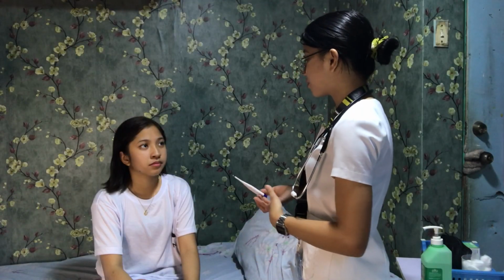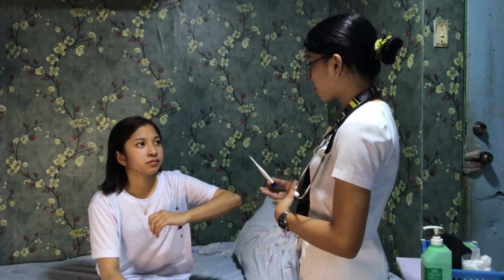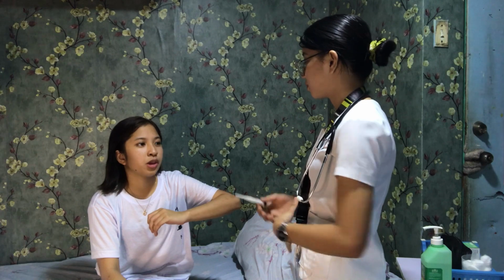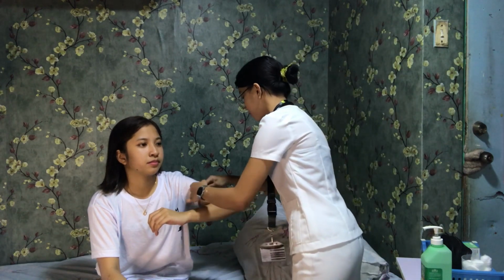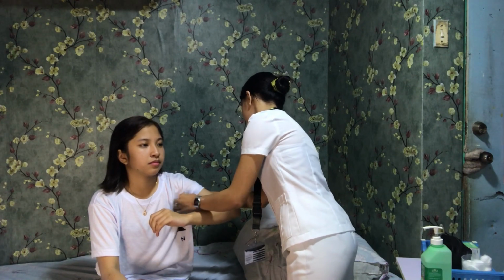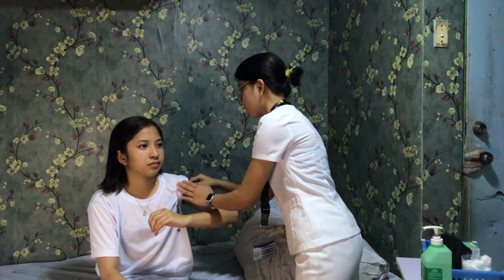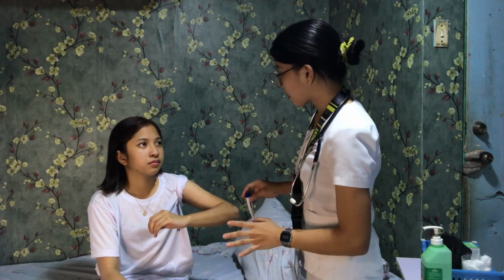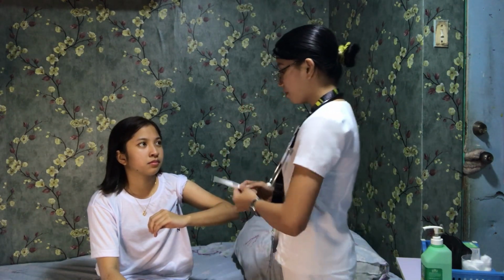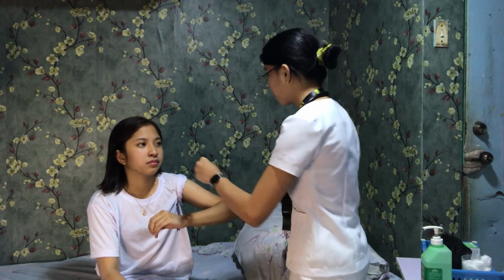Kindly please raise your hands for me. Okay, and I'm going to pull up your sleeves. Is it okay with you? It's okay. I'm going to pull up your sleeves na po. As I can see, the area is clean. So ma'am, since the area is clean, I'm going to put the digital thermometer in your axillary.